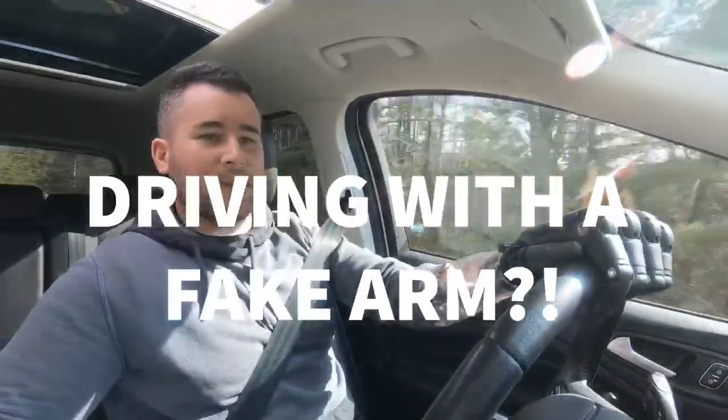Alright guys, today I'm finally going to start adding some content. I've been talking about adding content to this channel for a while now and just haven't gotten around to it, but I figure I'll start answering some questions I typically get on a daily basis about the arm — how I lost it, how I use it, where I got it — because I get all kinds of questions on a routine basis, especially in comments and private messages.